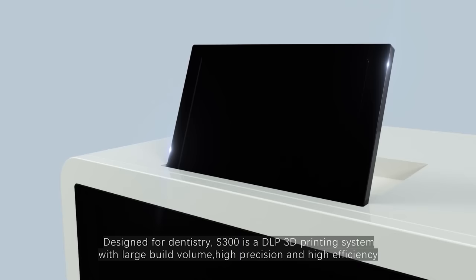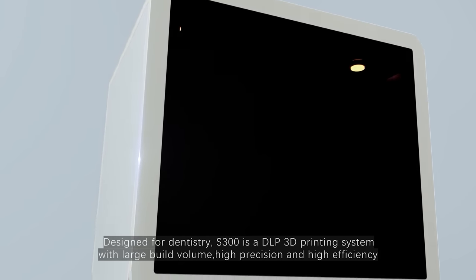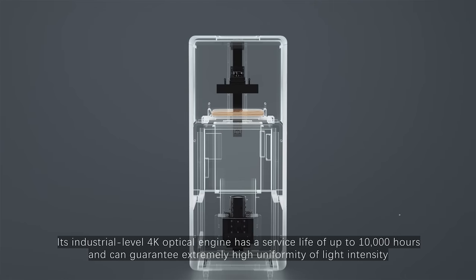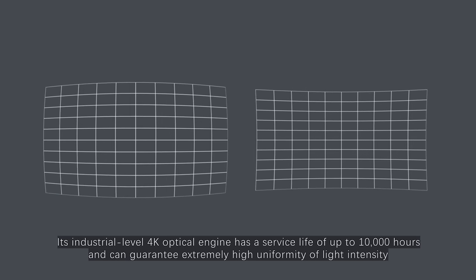Designed for dentistry, S300 is a DLP 3D printing system with large build volume, high precision and high efficiency. Its industrial level 4K optical engine has a lifetime of up to 10,000 hours and can guarantee extremely high uniformity of light intensity.